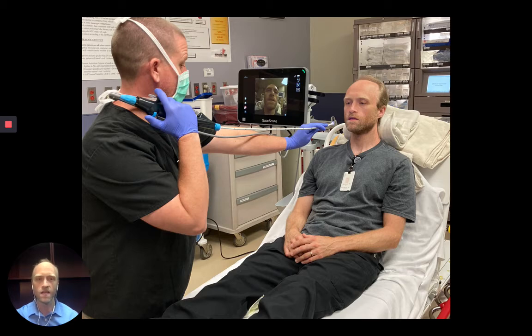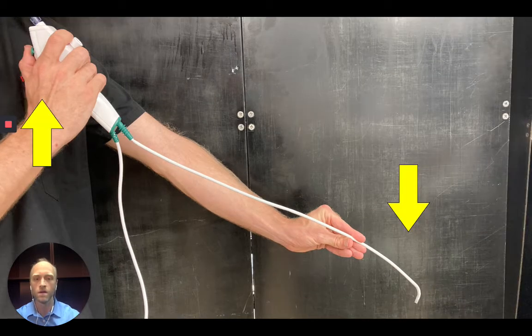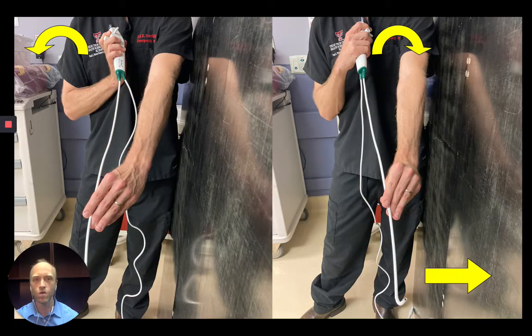It is preferred to have the right hand high to maneuver the lever and the left hand low to guide the scope. Keeping the scope straight will help you direct it. The basics of driving the scope are quite straightforward. Press the lever to direct the scope up, elevate the lever to direct the scope down, and with the lever engaged, twist the straight scope to either side in order to direct the scope to the right or to the left.